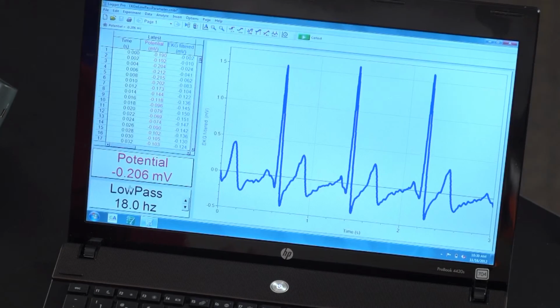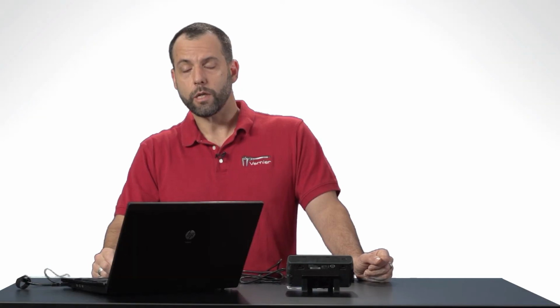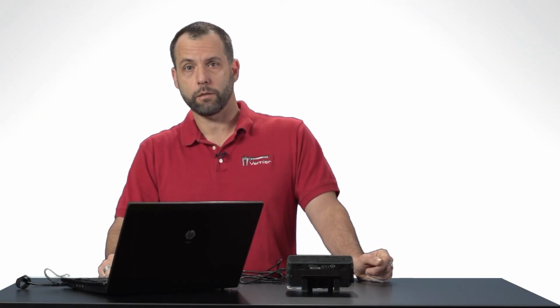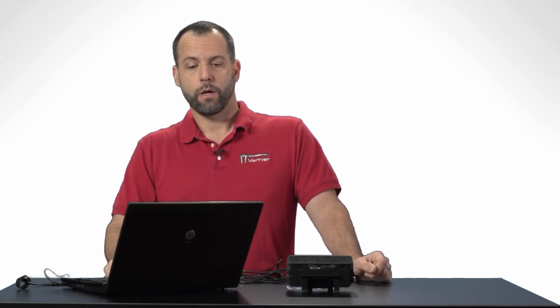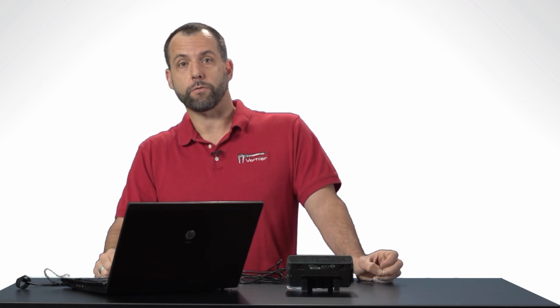So if I go down to this parameter control right here and if I want to get rid of some of this noise, these little traces, all I have to do is decrease this number by clicking on this little arrow. And you'll see that what it does is it does decrease the peak height, but it also makes the trace look cleaner. And that looks like a nice EKG trace. So this is just another way to record an EKG to get a nice clean trace. And it actually adds some STEM features to it because you can teach your students about digital filters and how to apply them.